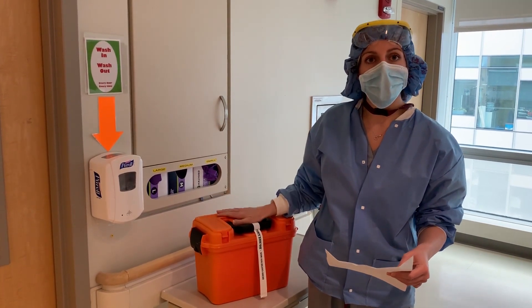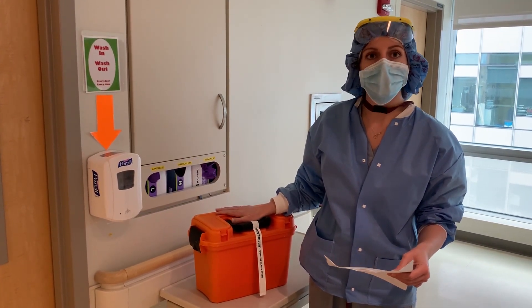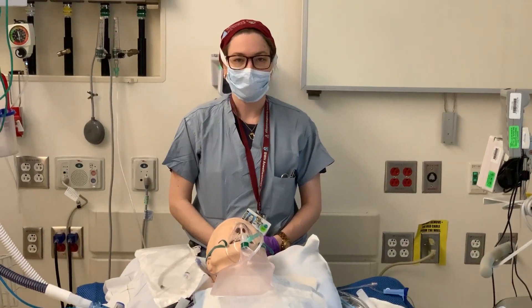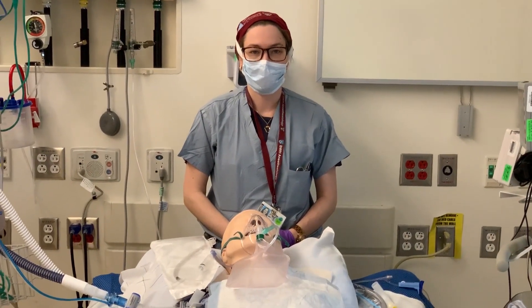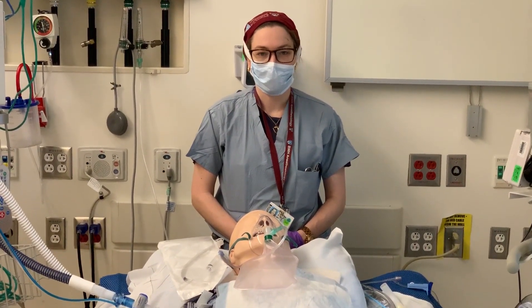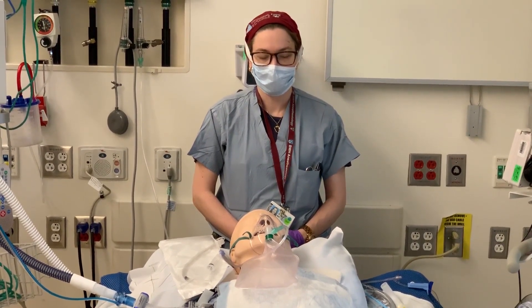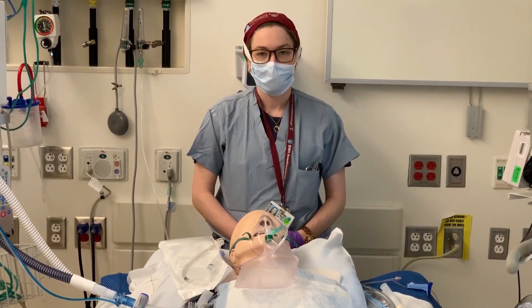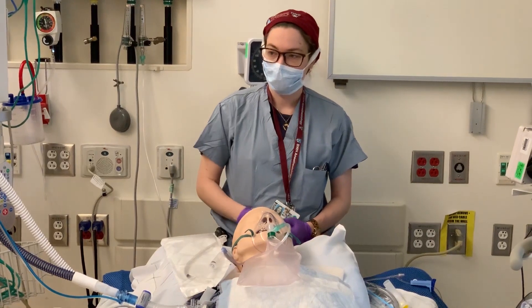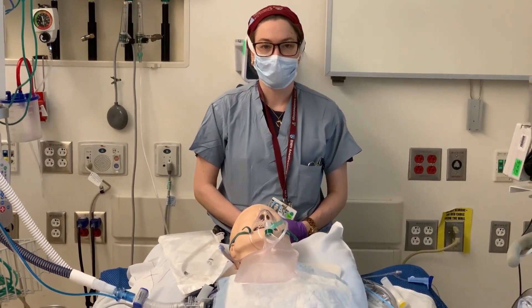Outside of the room, you will keep the tackle box outside and have extra rescue medications. Prepare all your equipment and ensure that it is within easy reach. Remember, the RN and respiratory therapist will be greater than six feet away, so ideally should not have to be nearby the bed to hand you things.